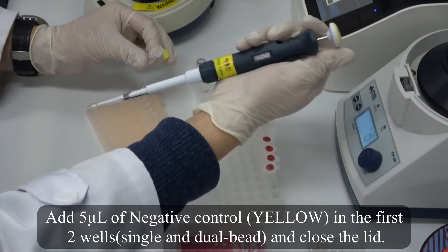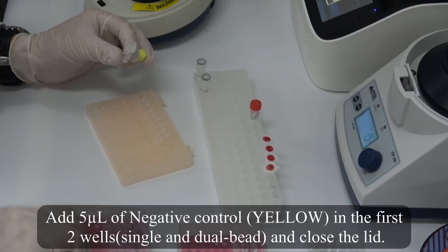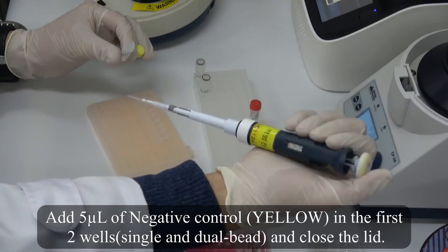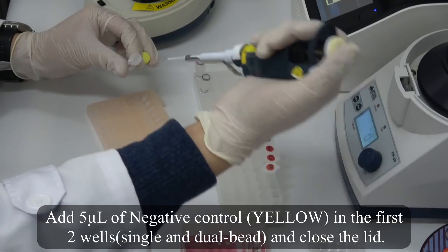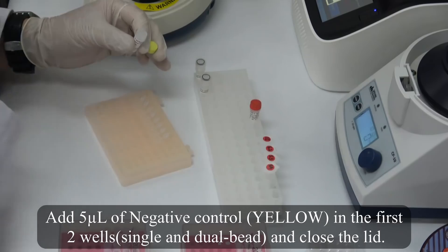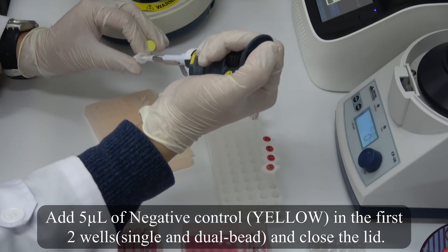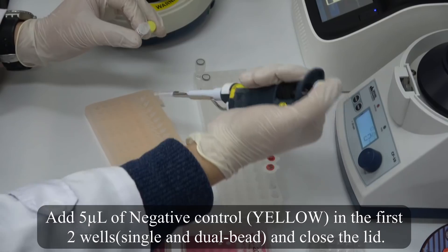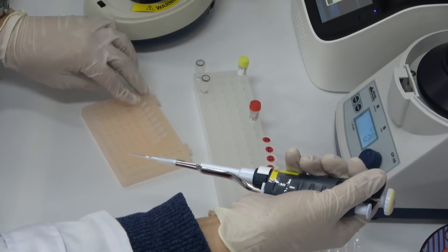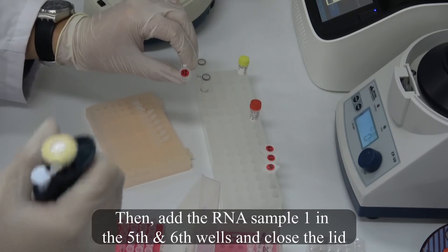Add 5 microliters of negative control (yellow tube) in the first two wells, single and dual, and close the lid. Then add the RNA sample one in the fifth and sixth wells and close the lid.